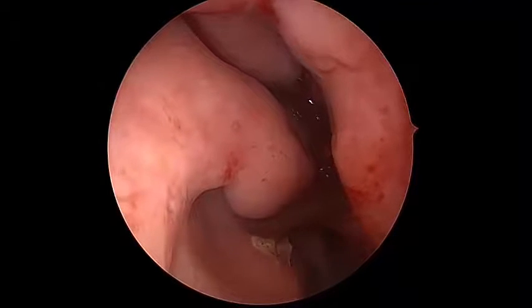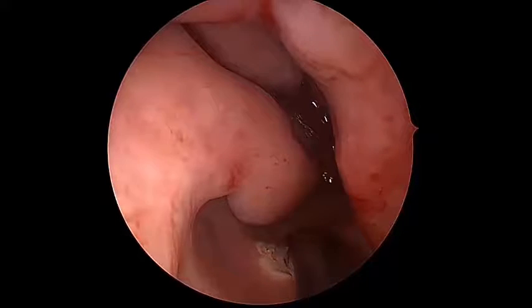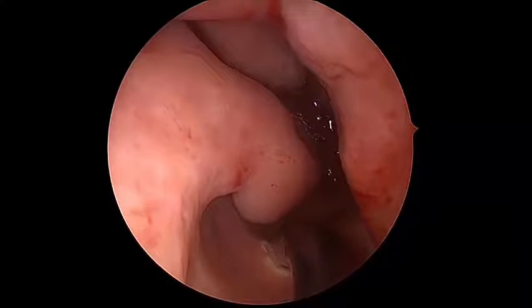Now it really is either another lesion or the same lesion that I'm finally getting. And you can see it's substantially bigger than what you saw — bigger than the tip of the mountain that you saw.